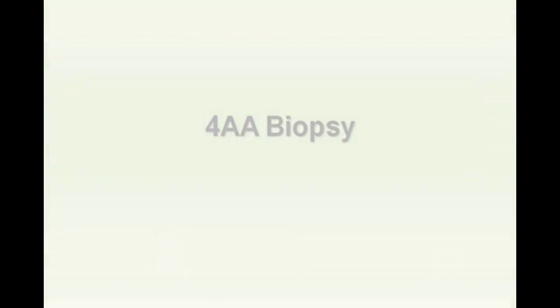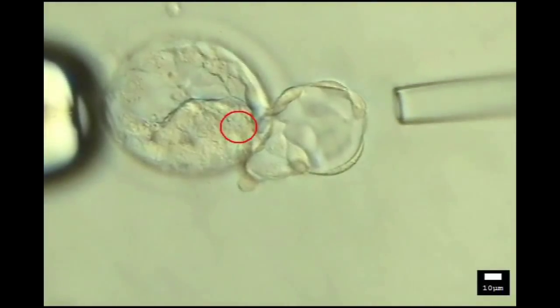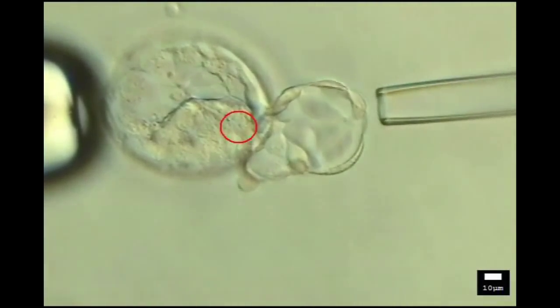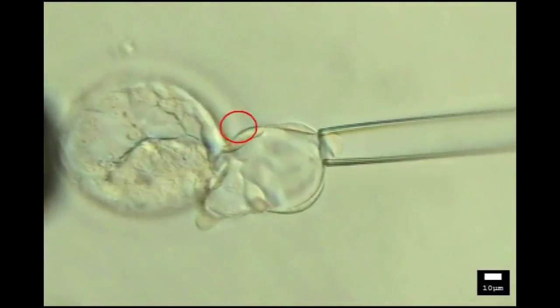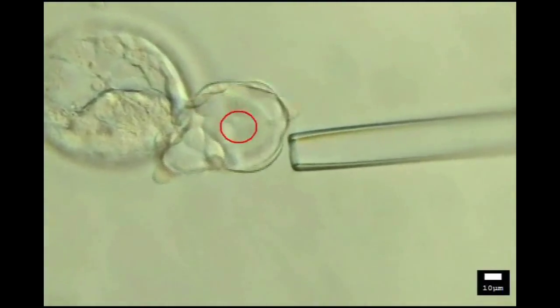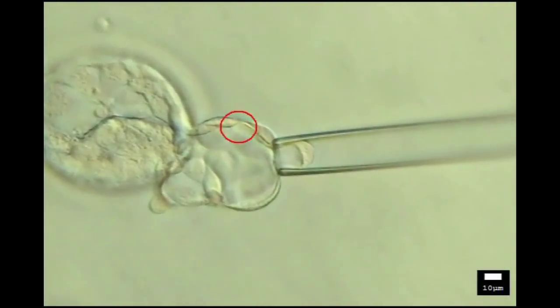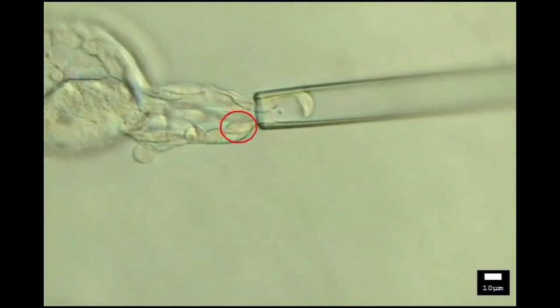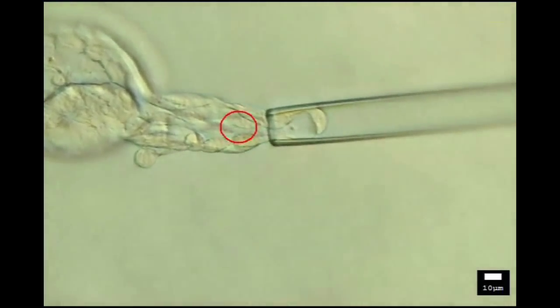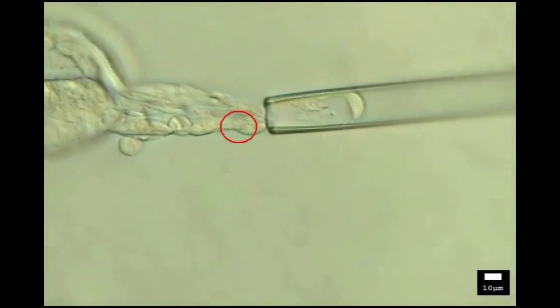A 4-AA biopsy. Note the focus is on the trophoblast cells, not the zona pellucida. A small diameter biopsy pipette is used and gentle suction aspirates the trophectoderm cells. The laser is applied at one cell junction away from the biopsy pipette. Manual pulling and 3 laser pulses result in a small trophectoderm mass.